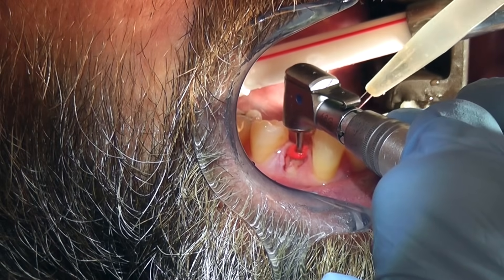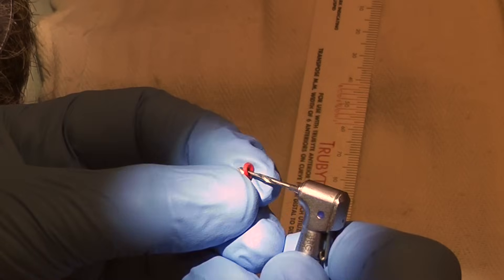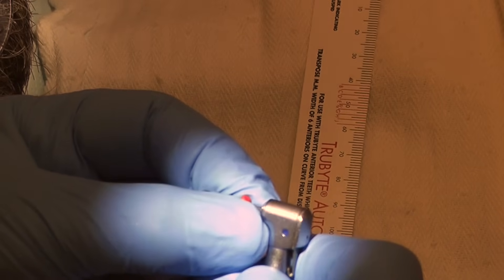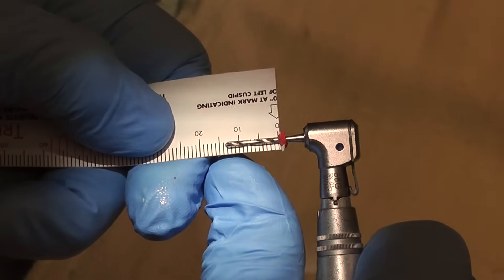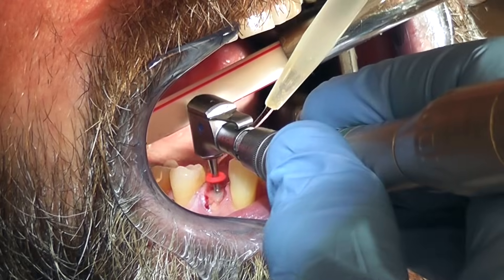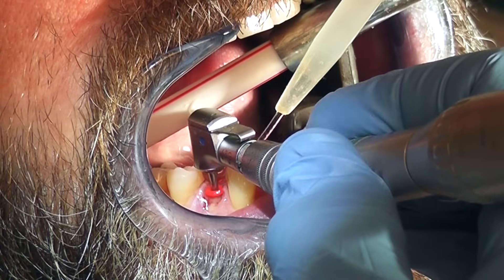Move it up and down like I'm doing here several times to completely bore out the canal. This is the second drill, which is the red drill, and then we'll finish with the blue drill. These drills have different diameters and different lengths.